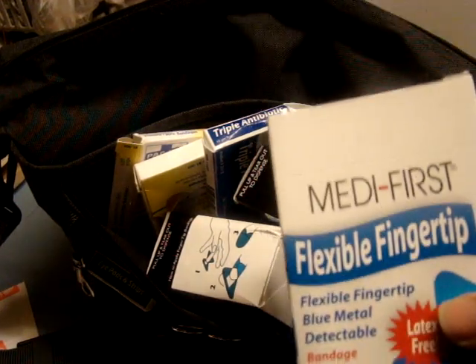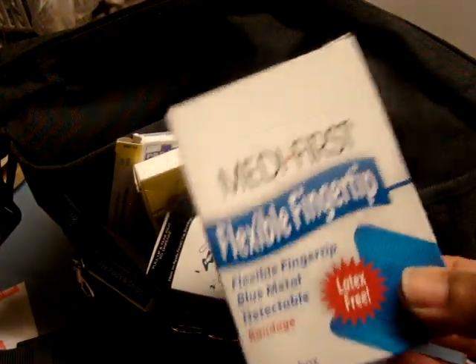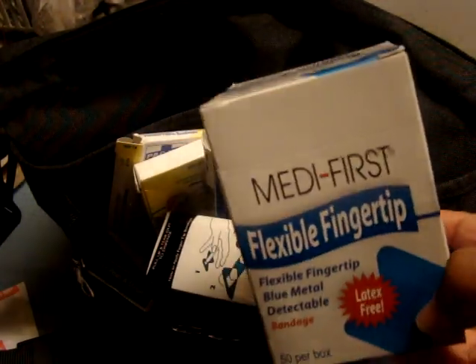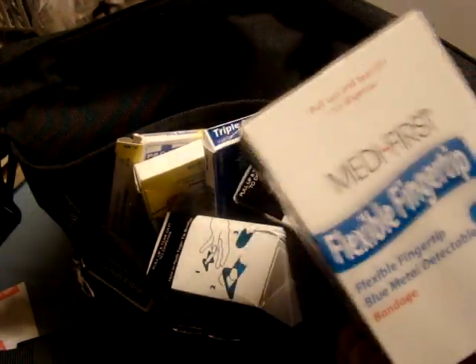Hello all, just doing a real quick video on the blue woven adhesive fingertip bandages. It does come in a box of 50, it's by Medi-First, and these are really, really cool.